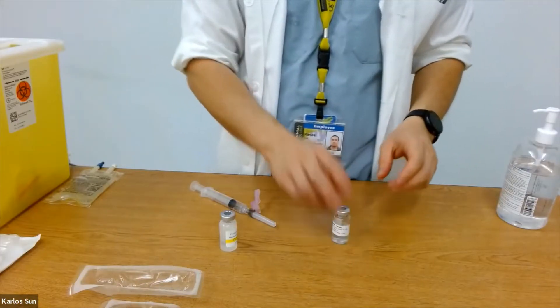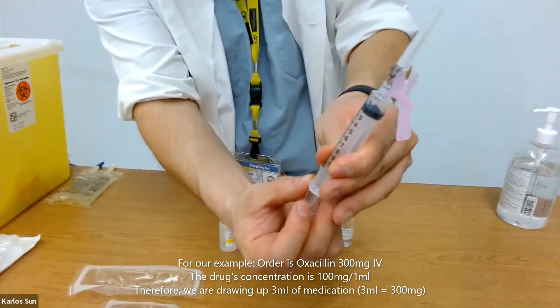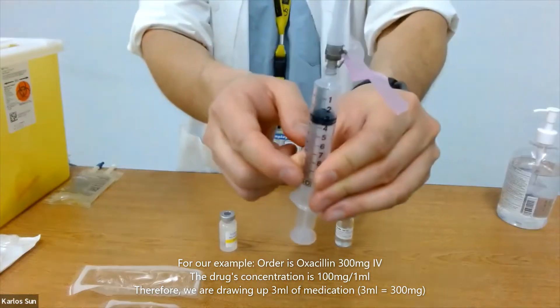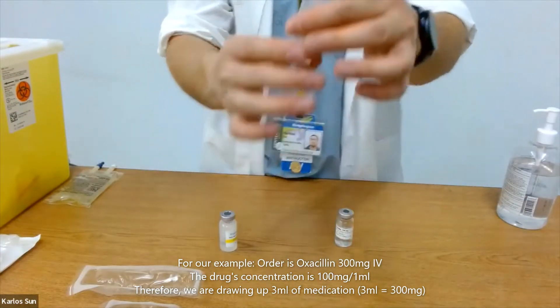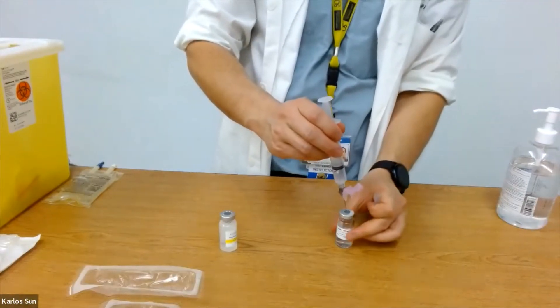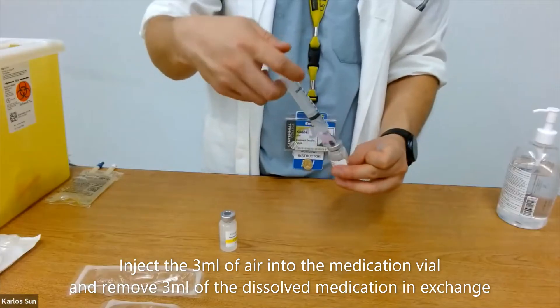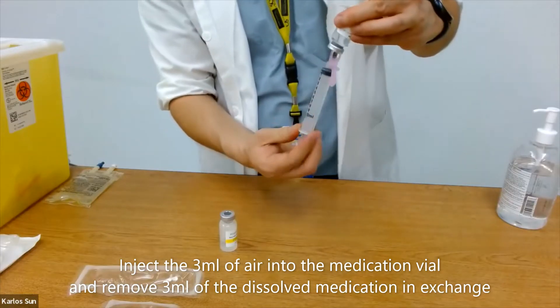Now draw the correct amount of medication. For example, our order is 300 milligrams. Our concentration is 100 milligrams per 1 milliliter. Therefore, we're going to pull out 3 milliliters. Inject 3 milliliters of air into the medication vial in order to remove the 3 milliliters of medication in exchange.